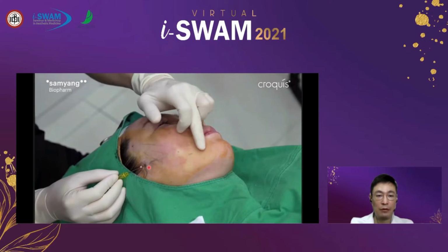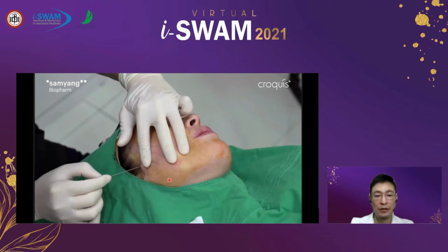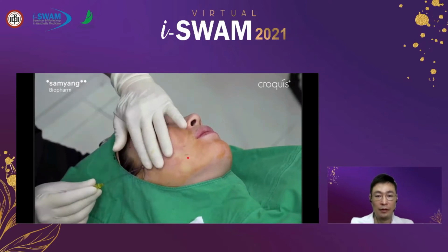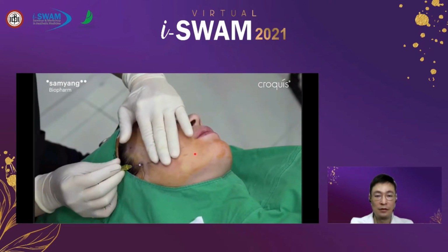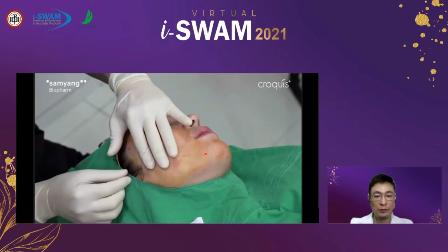And there is a parotid gland, as we all know. So you should keep the thread very superficially. Very close to the dermis. Don't go deeper. And when lifting the jowl, you can advance up to the fold, but do not cross the fold.